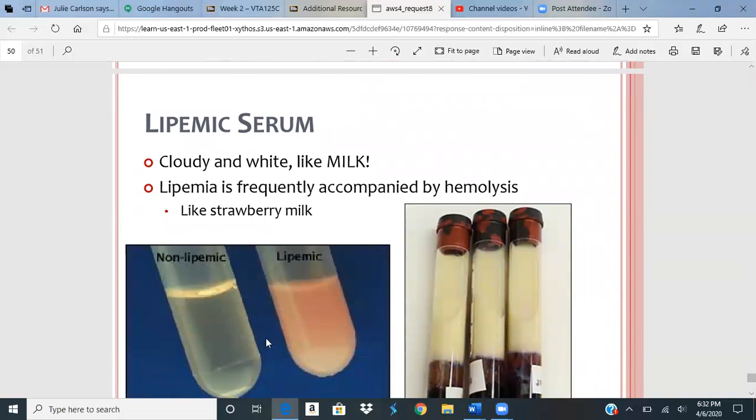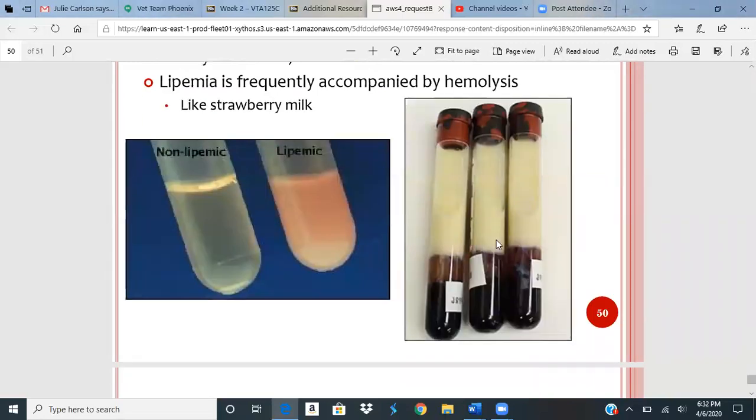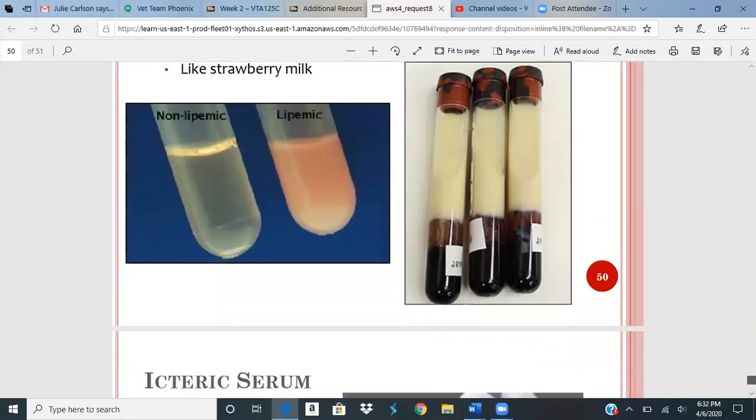Lipemic, that's the fat. Here's the other thing. Here's, let's say, a serum separator. We drew the blood. We've got the red blood cells here. We've got fat at the top here in the serum. If it's pink, that means it's also hemolytic. So we've got lipemia and hemolysis, and it legitimately looks like strawberry milk, which is kind of gross to think about, but now you see what it looks like.